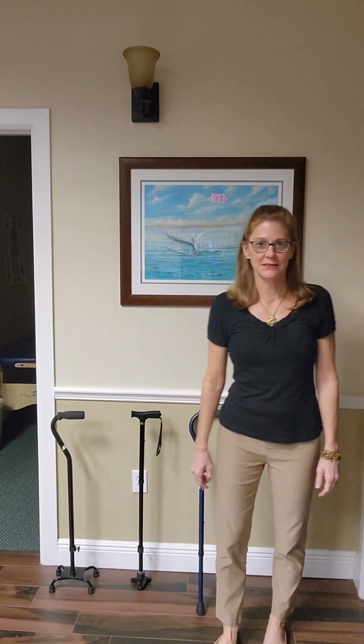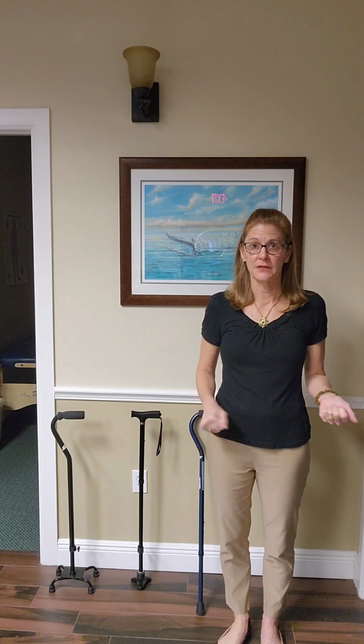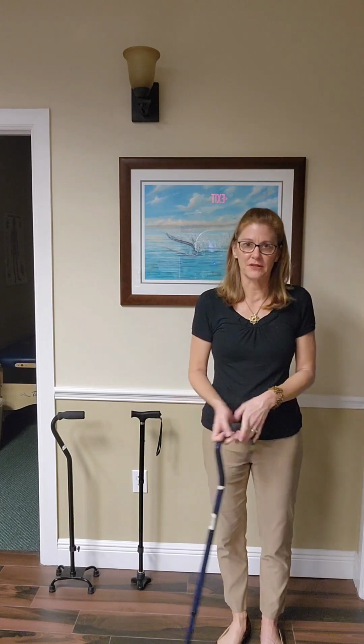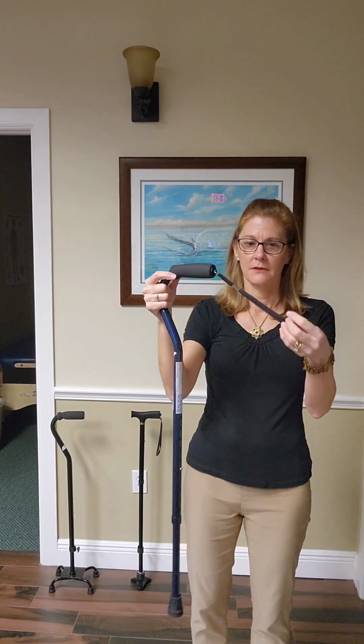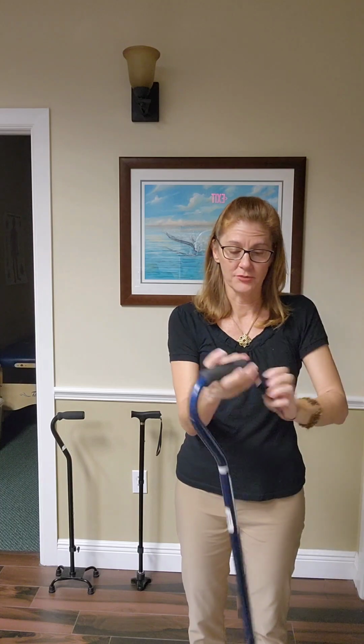Now people always ask, does it matter if I have a problem with one leg versus the other? For the sake of balance, again, for most people, it's just which hand they feel more comfortable with. So if you're right hand dominant, you're probably gonna wanna hold it in your right hand. If you're left hand dominant, you're gonna wanna hold it in your left hand. Some people like to hold it, and it's pure preference for balance, in their left hand if they're right hand dominant, so this hand is free. This little doohickey is nice. You can do that so that you're less likely to lose it and you don't have to stand it up while you do some things. Maybe a little annoying, but that's an option.